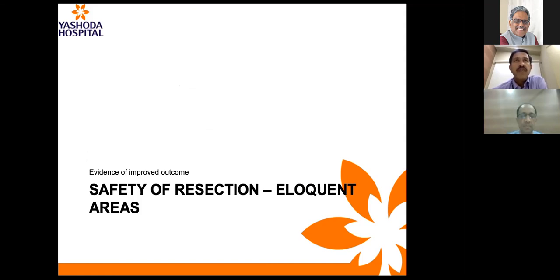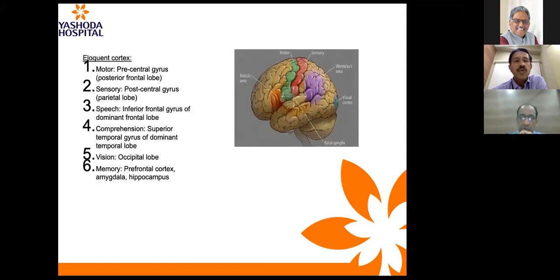It's not just if you have intraop MRI, you can do maximal safe resection for all patients. You need to use the pre-op image. You need to study the DTI images for seeing where the tracts are. You may have to do an awake craniotomy to see where the functioning tissue is, you may have to use intraoperative imaging, you may have to use fluorescence, and you may be using monitoring and mapping. So all of these give different information, and I'll show you how.